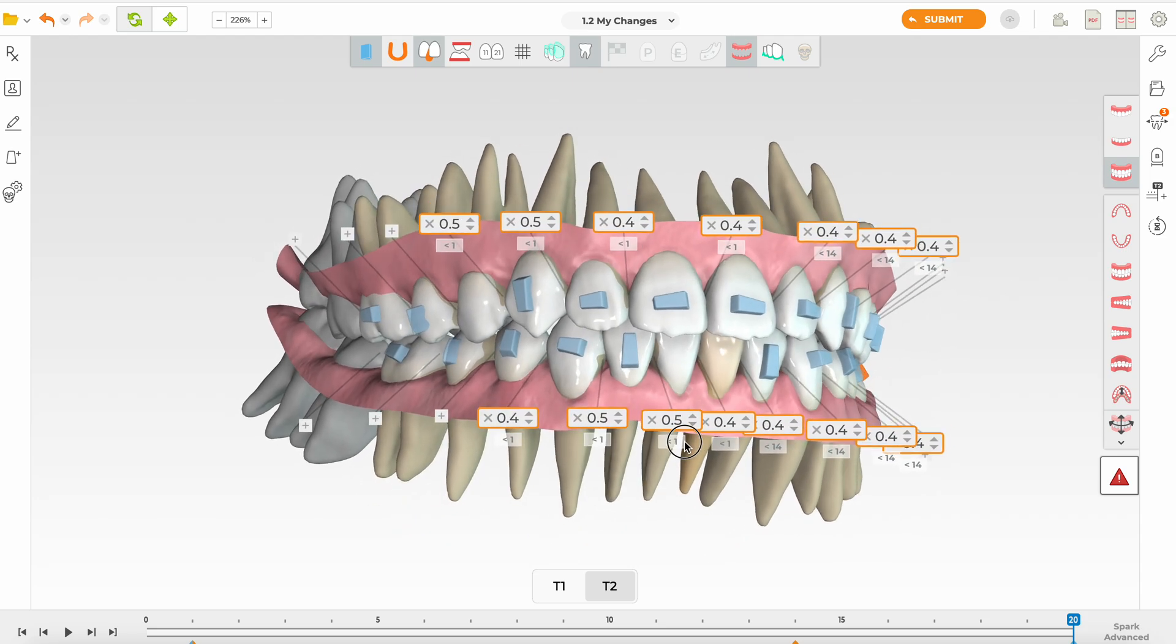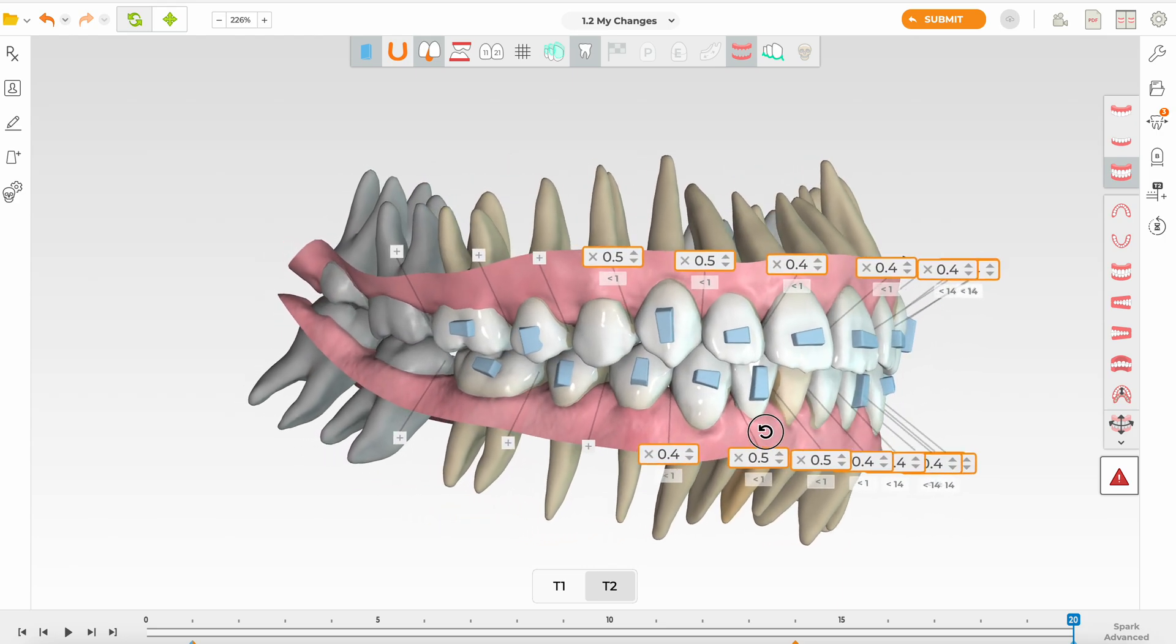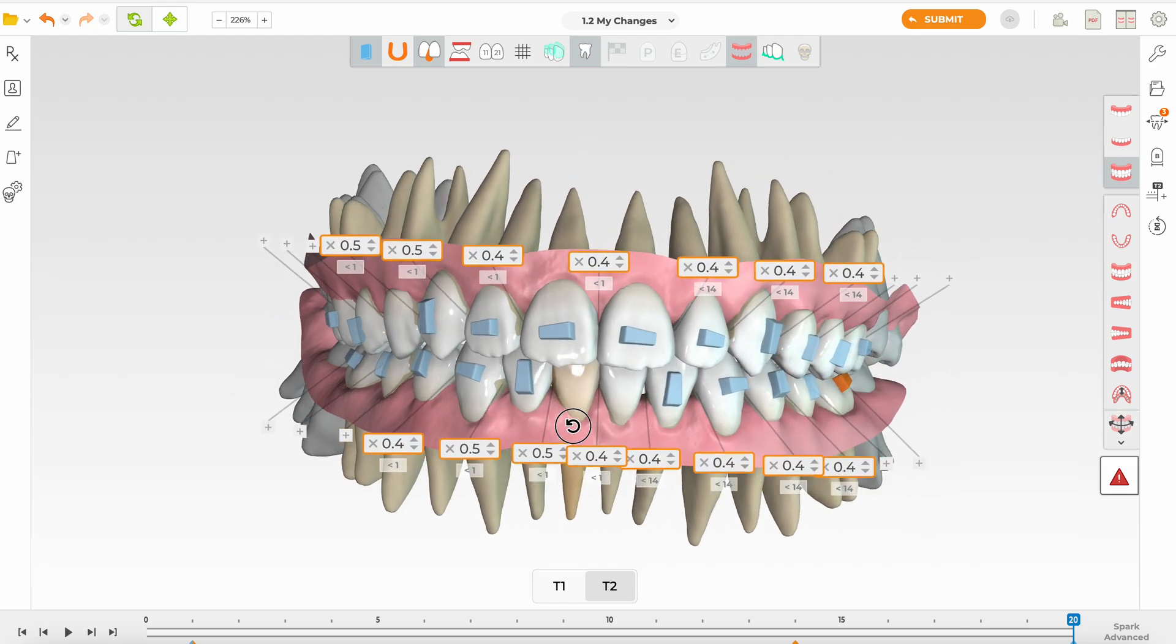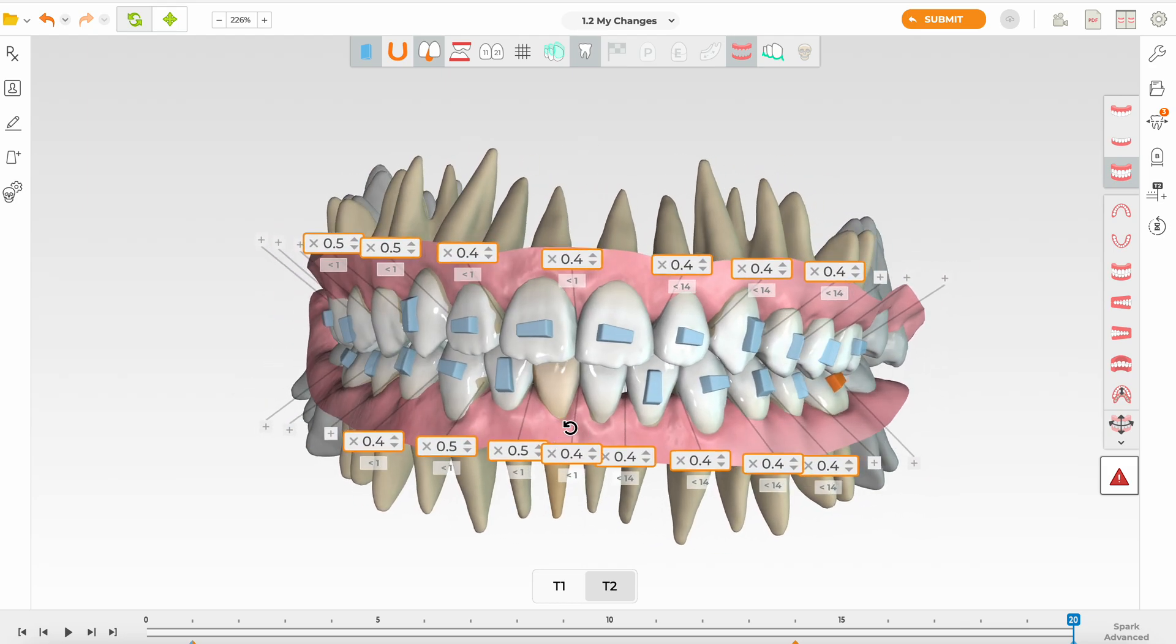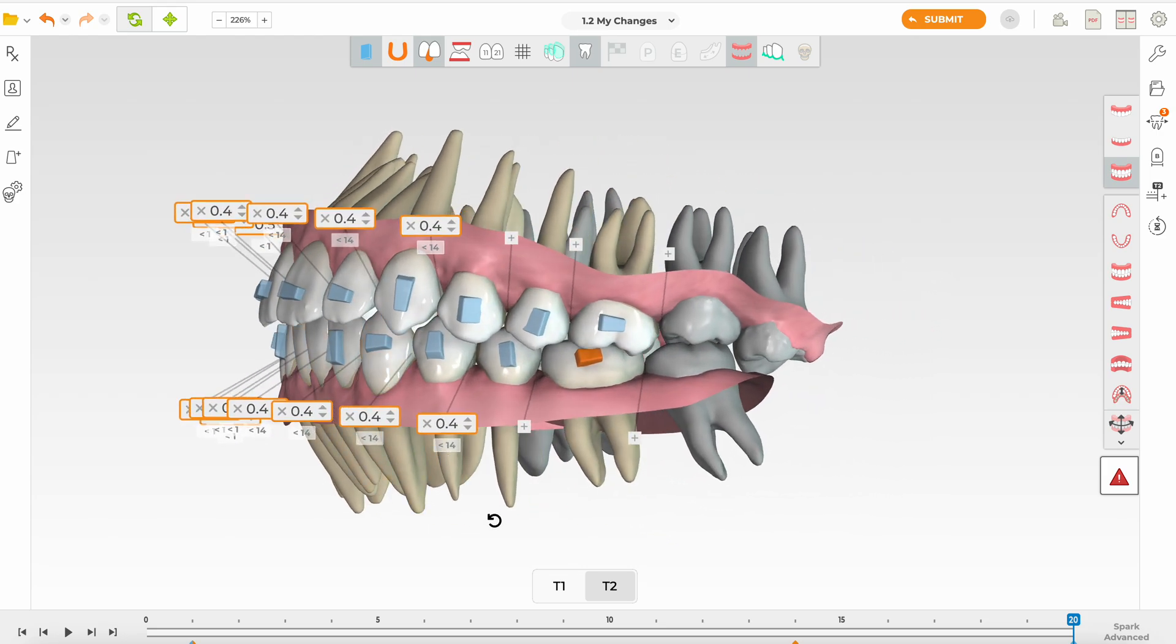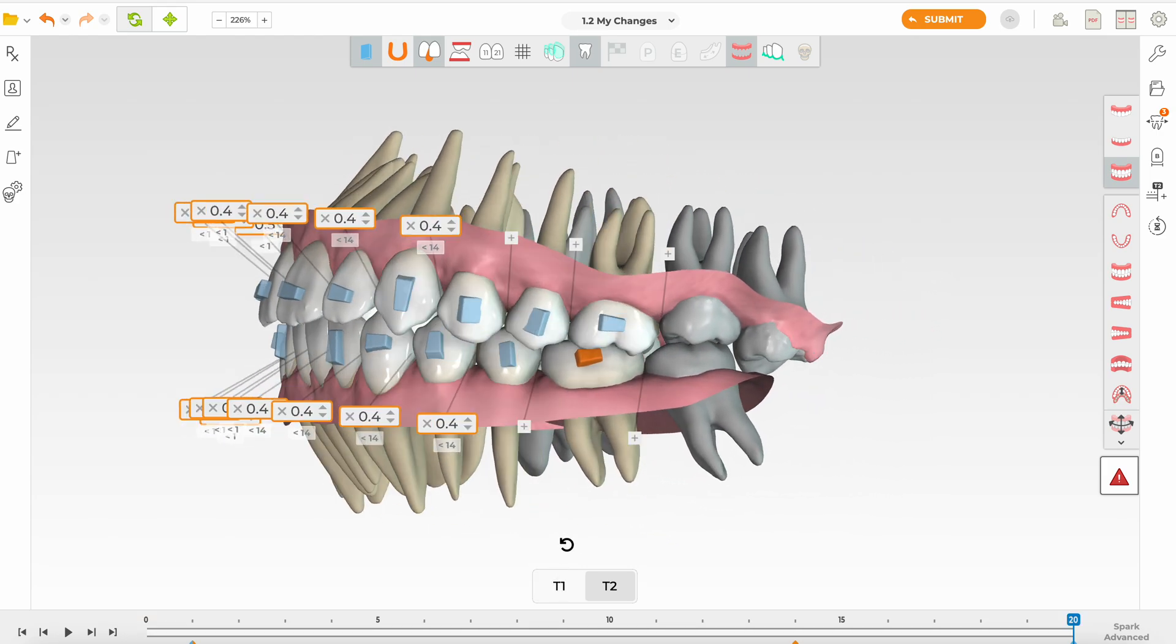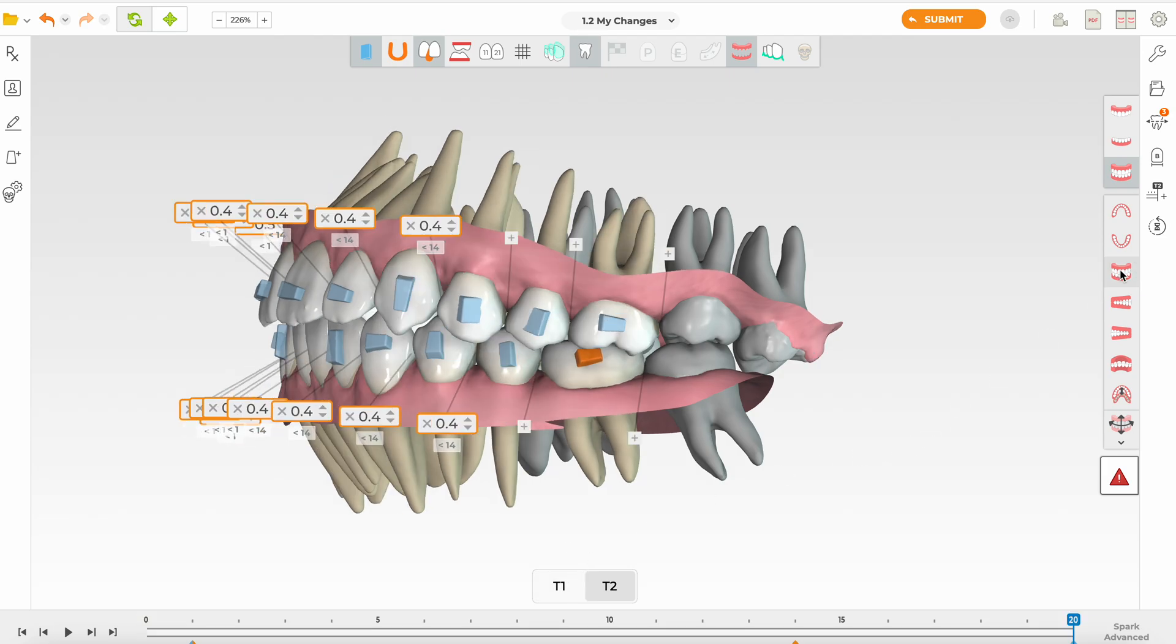The patient has bimax protrusion, patient has gingival recession across anterior teeth although it's mild, and most of the crowding is anterior. So if you're going to do really minor asymmetric IPR, that's not going to work for this patient. There's a lot of movement and you can see the amount of attachments I put.